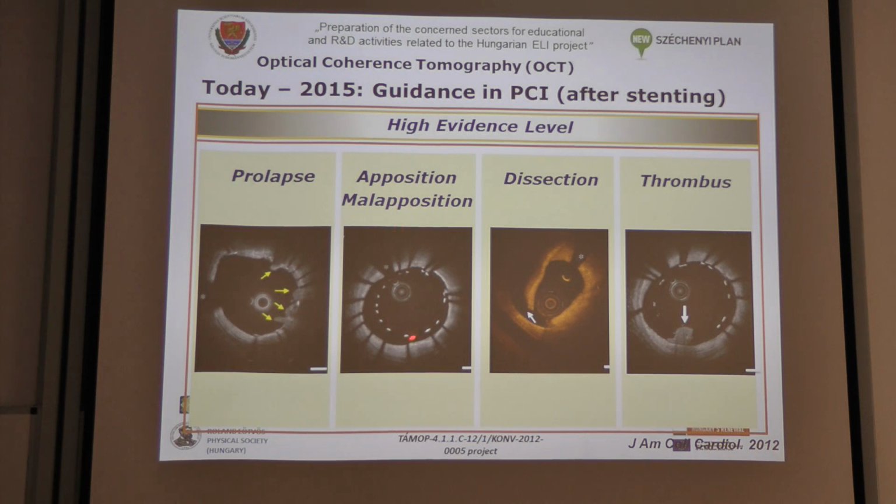So if the operator can see with the OCT but not on the angiography, he is prohibited to intervene. He is not allowed to.